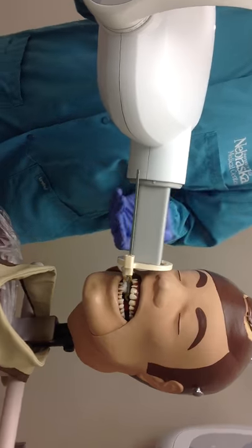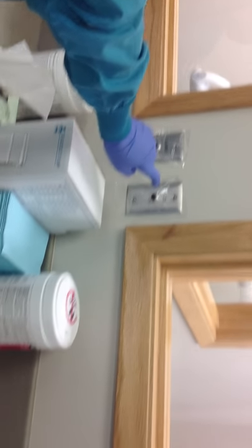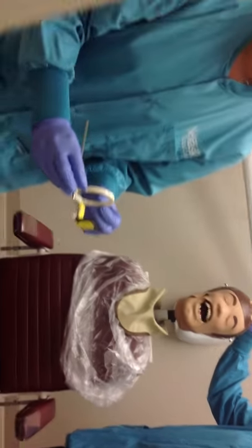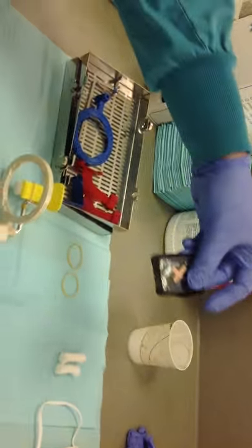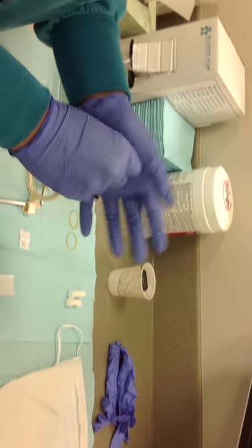It should be parallel with the XCP. Stand behind the window and press the exposure button until the beep stops. Move the XCP to the side and remove instruments from the patient's mouth. Take the phosphor plate out of the bite block. Remove the tab. Wipe it down with the tissue and place it in the cup. Do not touch the cup with your gloves.